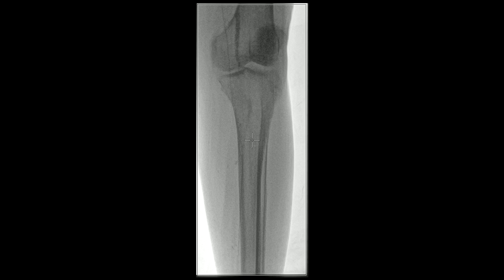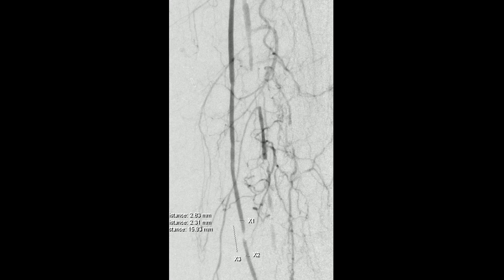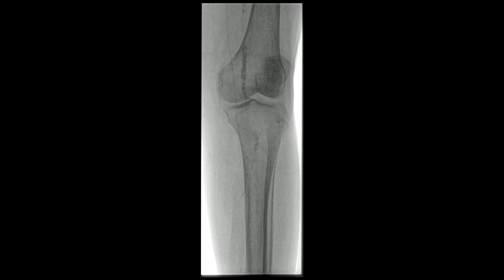The game plan is to use drug-eluting balloons for these stenoses, which are frequently used in this situation. Most stenoses in bypass grafts occur within the first 18 months. You can see the high-grade stenosis distally. There's also another stenosis at the bifurcation — those are the two we need to treat, including the mid-graft stenosis right behind the knee. You size the balloon to the bypass graft; it's probably five millimeters in diameter.